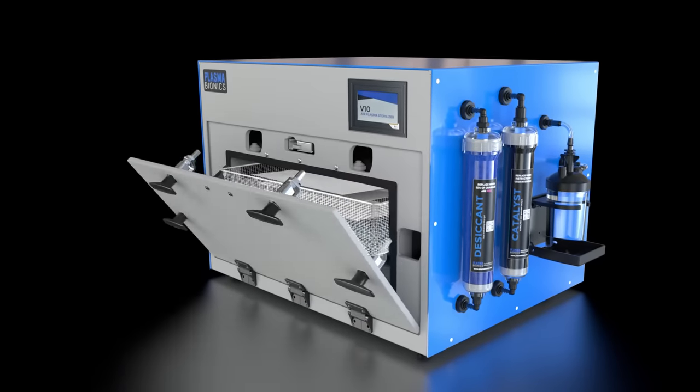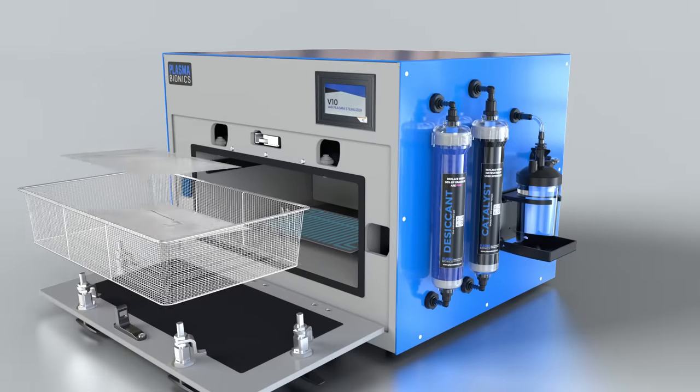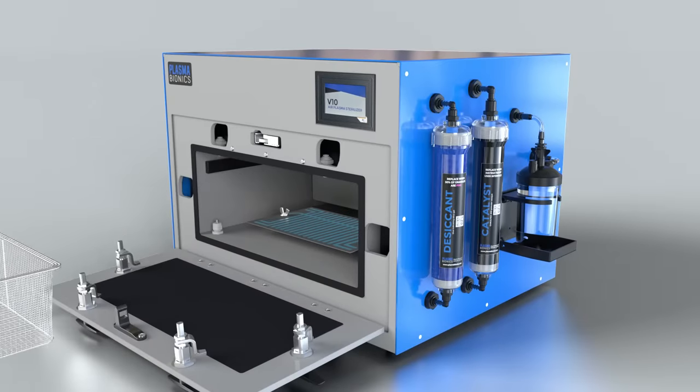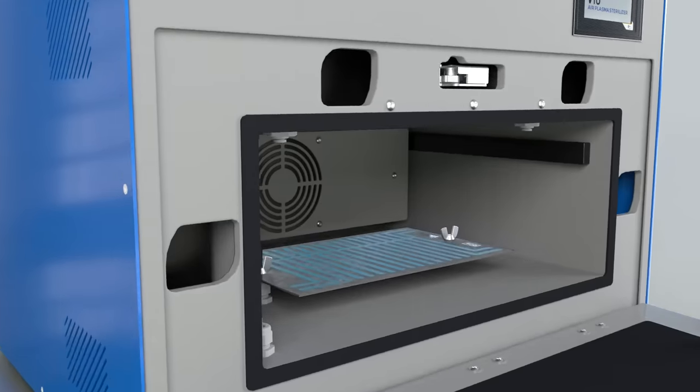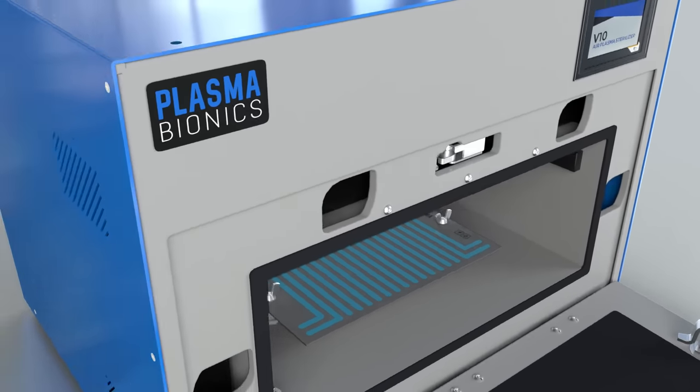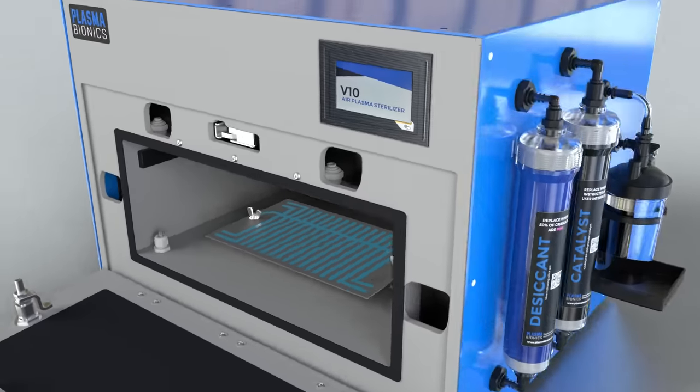Without the need for hazardous chemicals, high temperature, high pressure, or vacuum, the V10 Air Plasma Sterilizer is safe, easy to use, cost-efficient, and ready to redefine veterinary instrument sterilization for your practice.